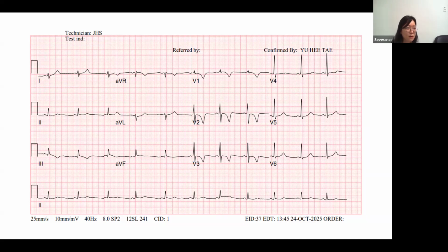Okay. Tom, any other comments? Question: what if you map below the annulus? If the pressure is such that you can go below and then like this. Oh, I see. Sometimes the unipolar catheter touches the annulus area, and it is hard to make contact of the ablation catheter to the endocardial side. So you mean put the ablation catheter beneath the unipolar catheter to make better contact.